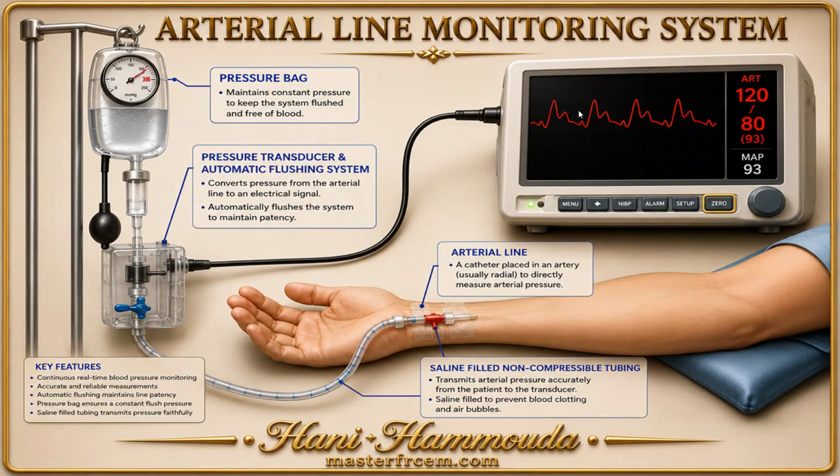Easy? Yes. So number one, the three-way down. You have tubing down and the tubing up. Tubing down to the patient, tubing up to the normal saline. Clear? And the cable, of course, to the monitor. Just it. So the pressure bag should be up to 300. Can you see? Yes. And the arterial cannula and the line at the same level of the heart.